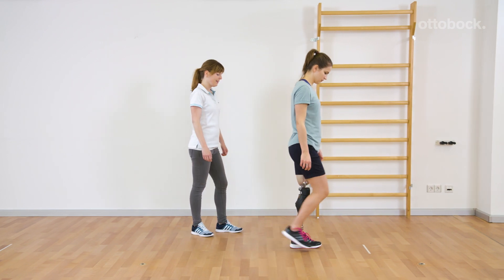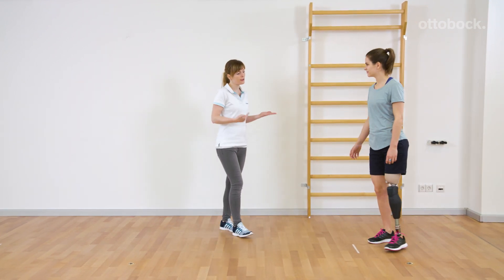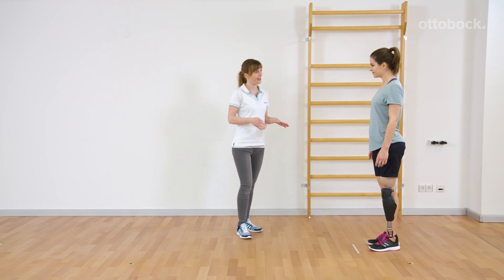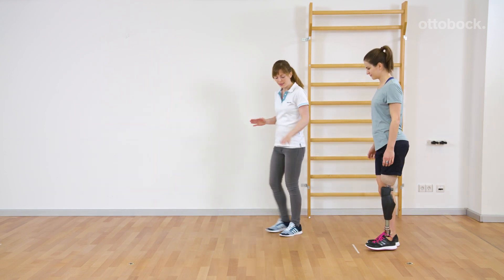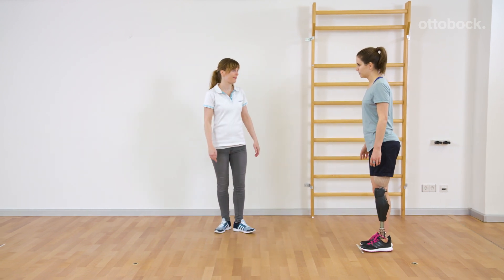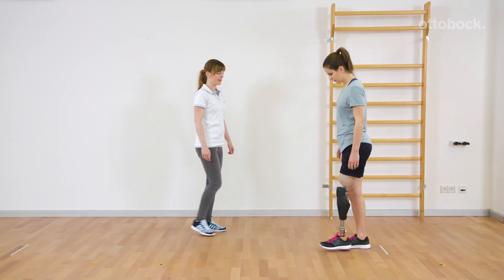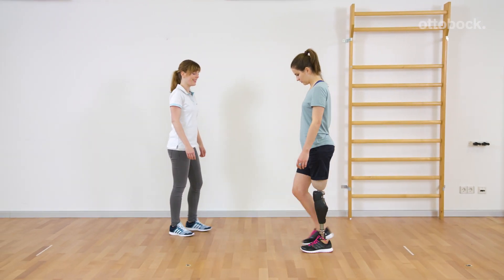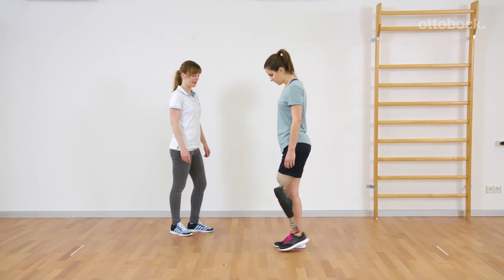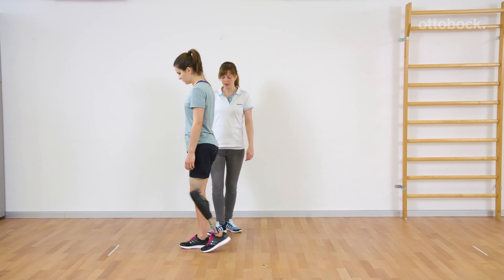Reka feels that she can achieve stance release even with very small steps. Franziska always encourages Reka to roll over the entire foot. This improves walking technique and Reka figures out the functionality of the prosthetic knee joint. Half foot size is the realistic step length where an advanced user is still able to walk quite fluidly.